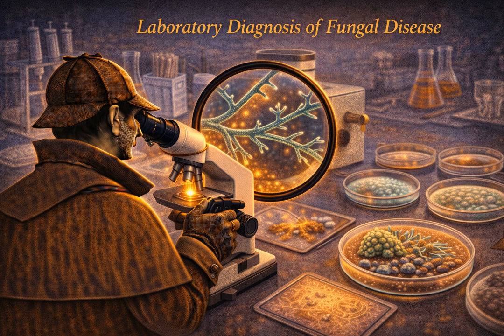You take a tiny bit of the yeast colony and mix it into a small tube of serum, usually rabbit serum or human plasma. You put it in the incubator at 37 degrees for about 2 or 3 hours. Then you take a drop, put it on a slide, and look at it under the microscope. And what do you see? If it is Candida albicans, the yeast cells will have started to sprout. They grow this long, continuous tube-like extension right out of the side of the cell called a germ tube. It looks a bit like a hand mirror or a sprouting seed.